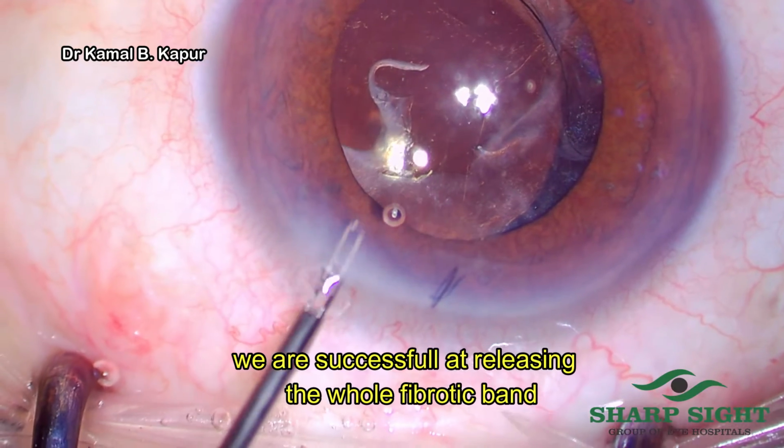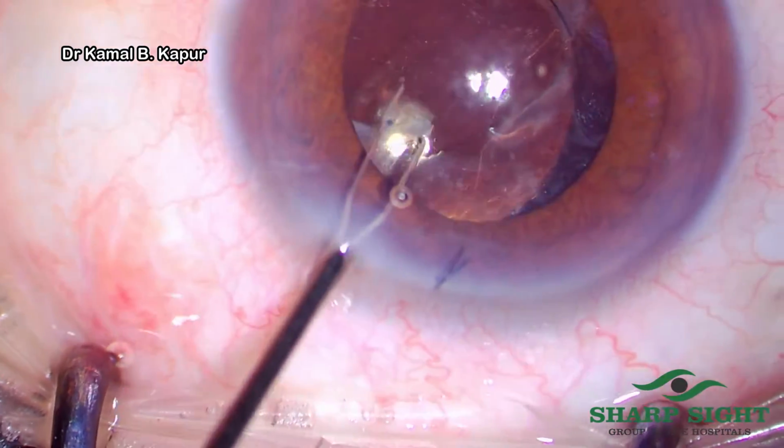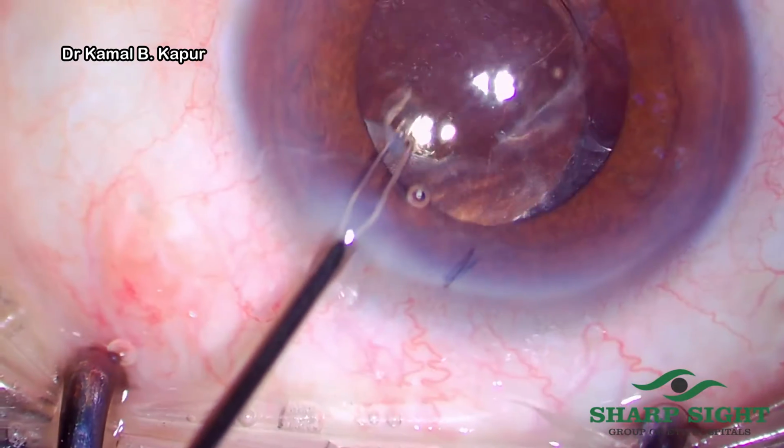Now we want to extend and break as much of this band by the tearing movement in that area which is hidden from us under the iris.